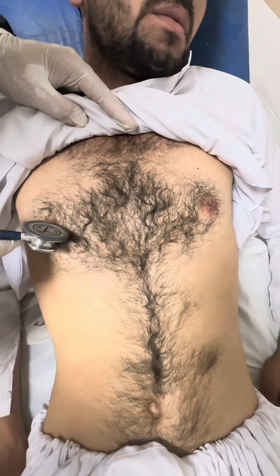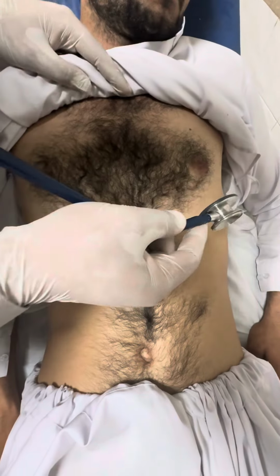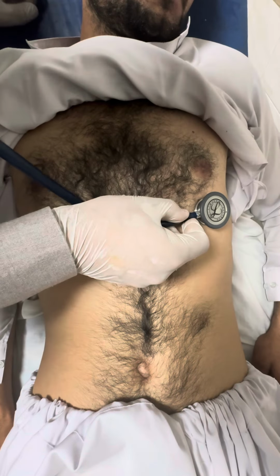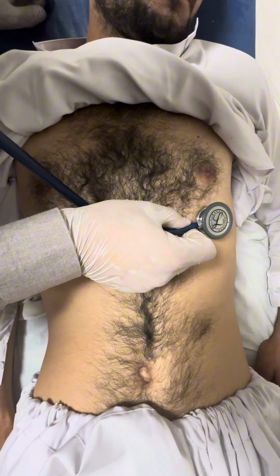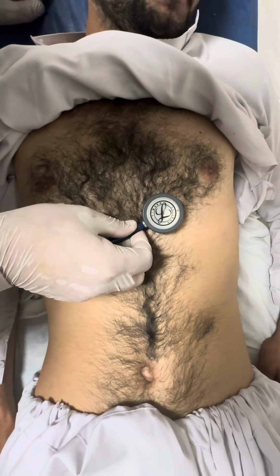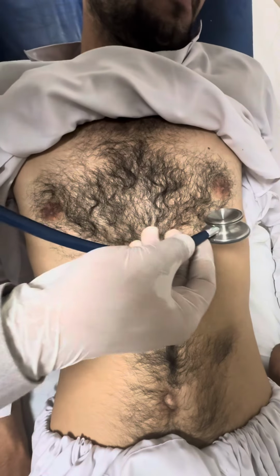So here we auscultate the four areas: mitral, tricuspid, pulmonary and aortic. S4 and S3 are low pitch sounds, so we will auscultate these sounds with the bell of the stethoscope. We will auscultate it in the mitral and tricuspid area.